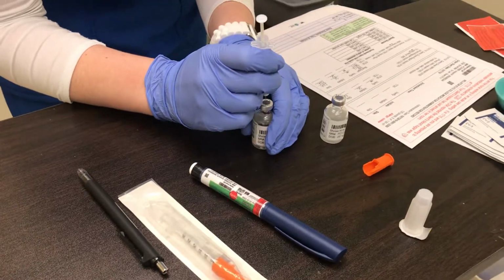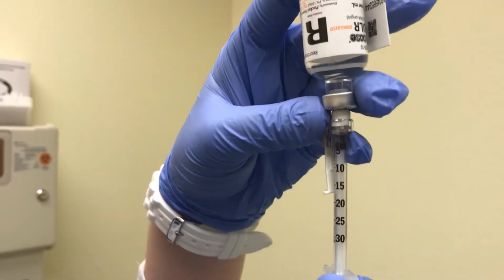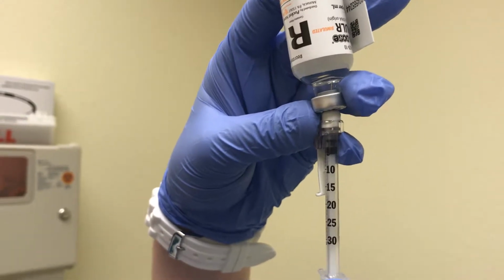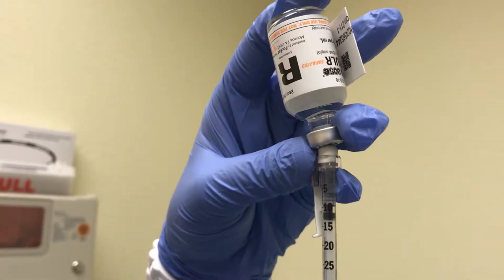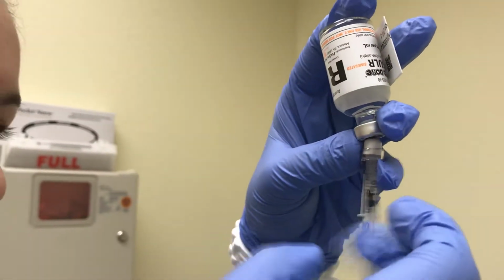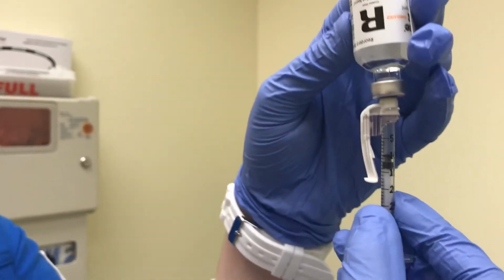So I will need 10 units of air. And then I can start to draw up. So I'm just going to turn this so you can see the regular. And then I will need 10 units. Okay. Just make sure I get that air bubble out of there. Okay, so you see that I have the regular insulin and I have 10 units of that.